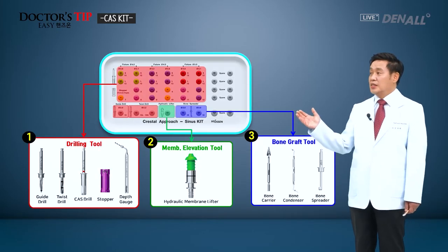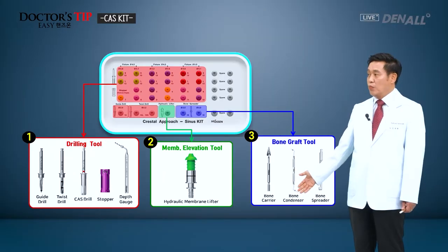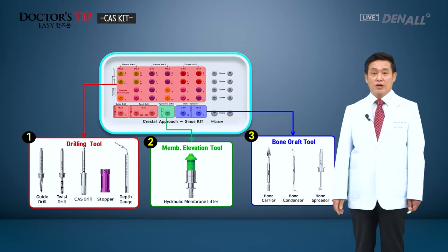Components of the CAS KIT. Basically, there are drilling tools, the CAS drill. Second, after penetrating into the sinus floor, the sinus membrane can be easily hydraulically elevated using the hydraulic tool. And the bone carrier and condensers are the bone graft tools. Three types of tools are available.